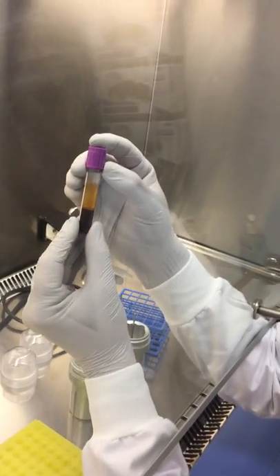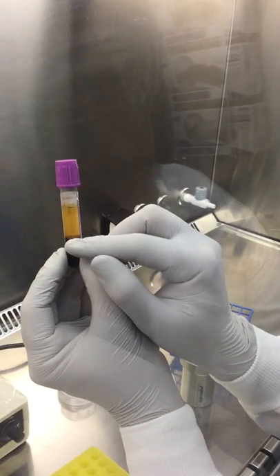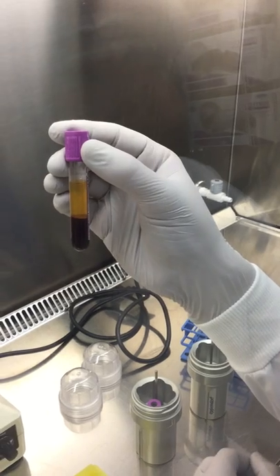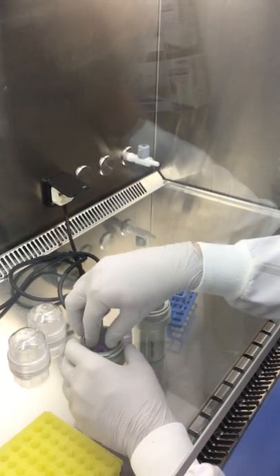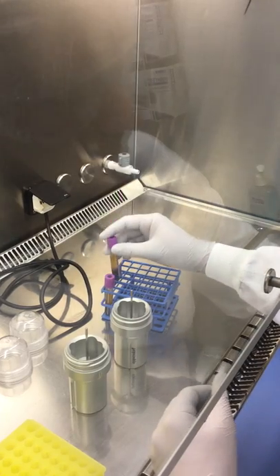As you can see, we've got three fairly distinct layers. We have our plasma, we've got a very thin layer of Buffy Coat just there, and then the rest of it, the red cells that we're going to get rid of. And the same again for this tube, separated very nicely.